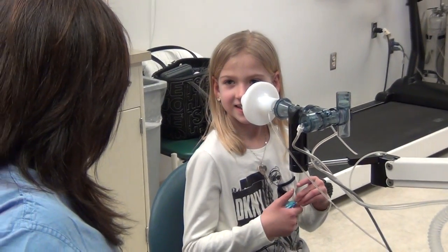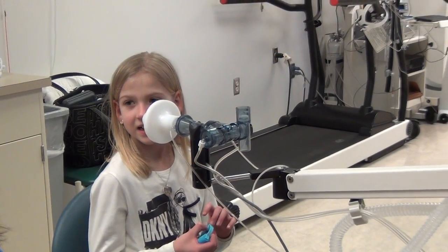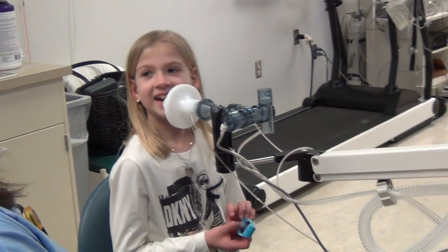Fran, this is your breathing muscle and it's right here. So if you're slouching down, you're not going to have a nice big breath. So sit up nice and straight.